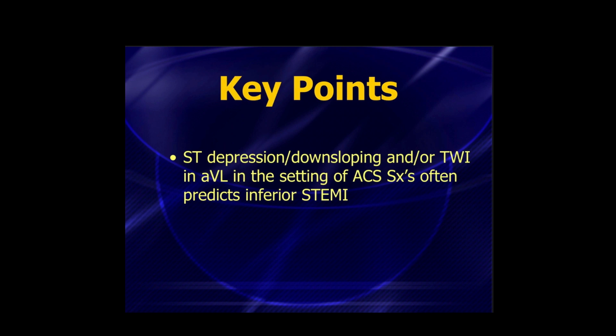We're going to keep talking about it because it is so important and still being missed. ST segment depression or downsloping and/or flipped T wave, that's T-wave inversion, in AVL, in the setting of some concerning symptoms, often predicts an inferior wall STEMI.